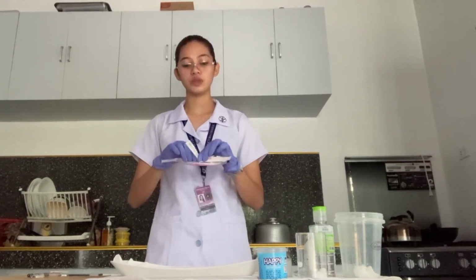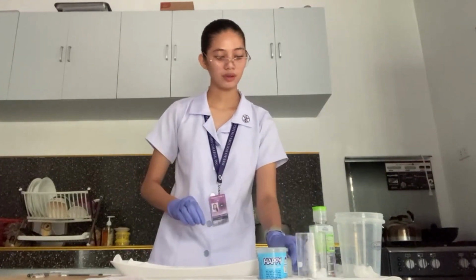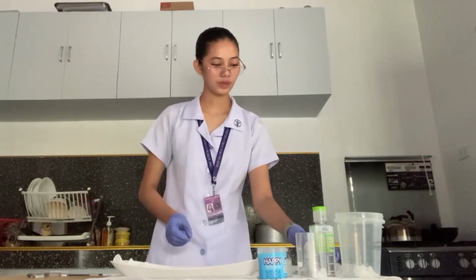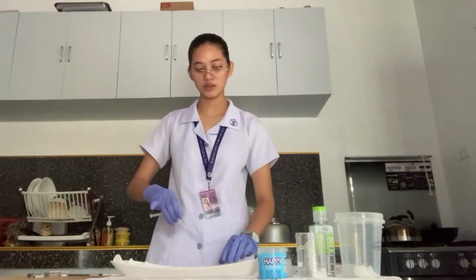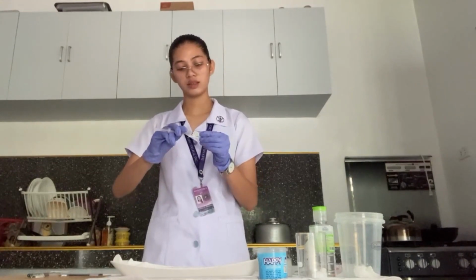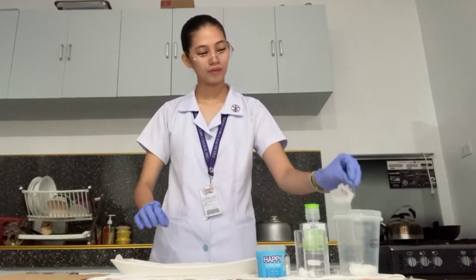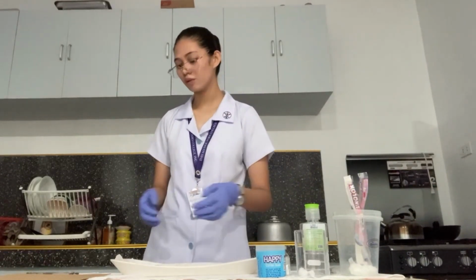And we're going to change our needle with the needle that we will be using for the actual administration of the medication. We will grab our needle, which is gauge 23, then open it, grab the syringe, uncap or twist the syringe from the needle, and then retwist it on this. After that, we're going to place it into our hypodermic tray, throwing all of the waste to our waste receptacle.